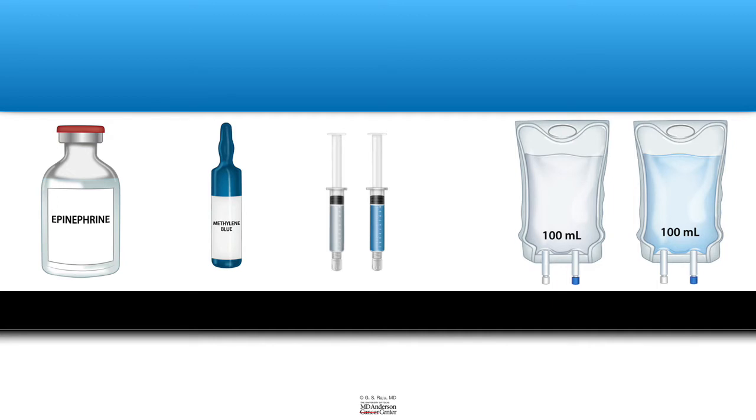When you see a flat polyp and you want to inject saline or any other solution into the submucosa and lift it above the muscle, you need to know how to prepare for that. So you can inject plain saline or one of the solutions that are readily available in the market.